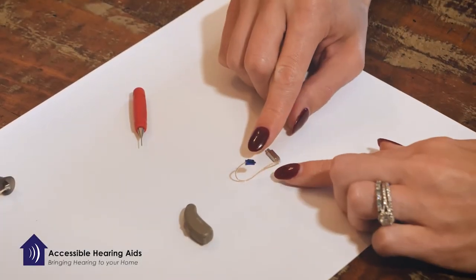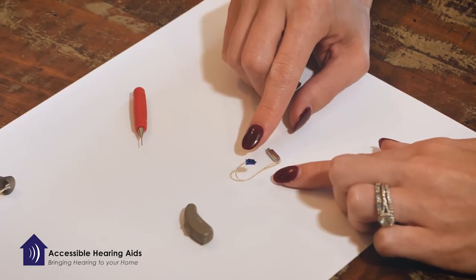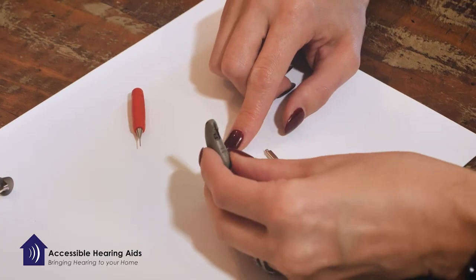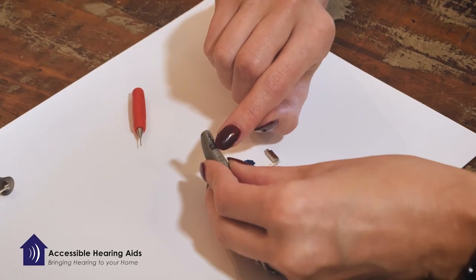Then you will take your new receiver or wire and put it back in place. The easiest way to do this is to grab the hearing aid and face it where you can see the opening.